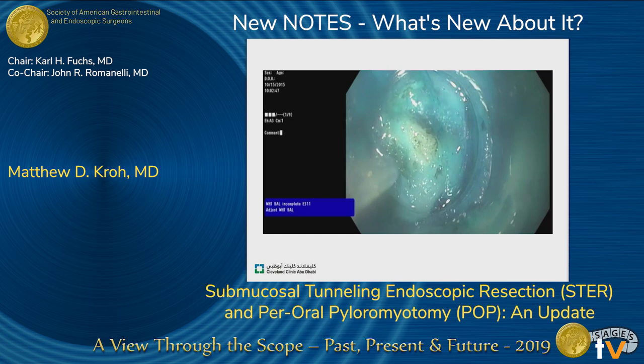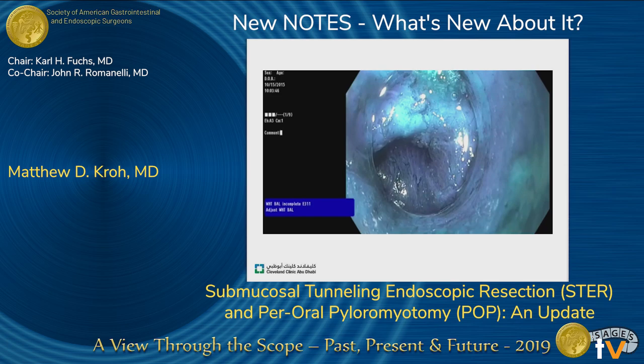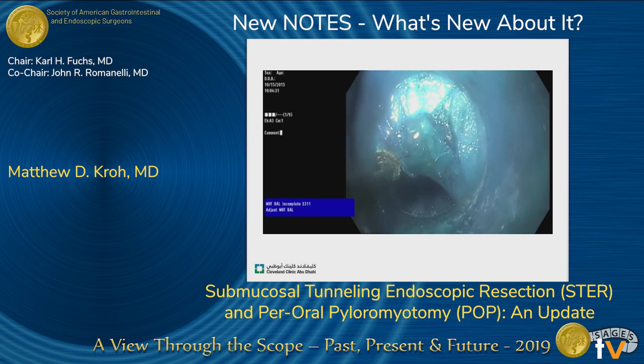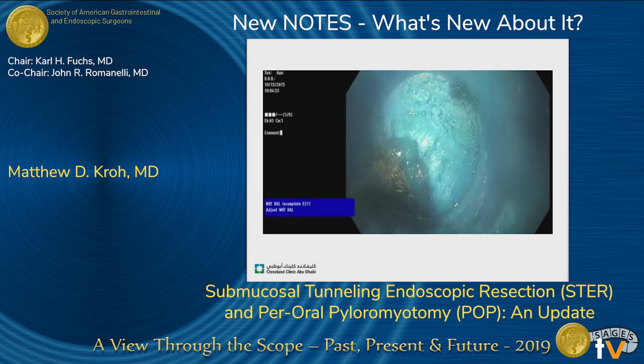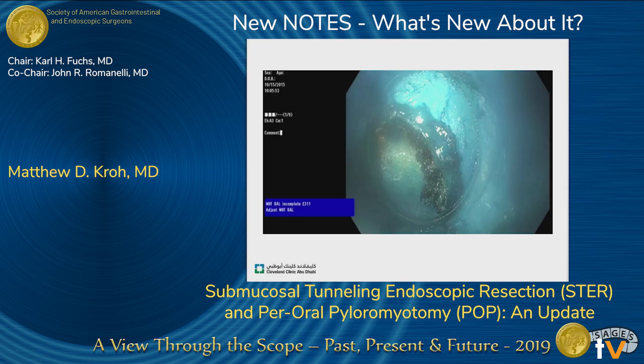Re-injection to identify the difference between that loose areolar tissue, the mucosa, and the muscle makes those planes a little bit easier and actually does a nice dissection as well, which you'll see here. When we come down to the pylorus, it's quite obvious what that looks like. In some ways, it looks like a ring of calamari, I think. But you can see the white muscular layer there, and we divide that usually distal from the duodenum back onto the stomach for 1 or 2 centimeters with division of those muscular fibers. Similar to POEM, it's very controlled, and you can see the fibers separate and the cap will allow for lateral dissection.